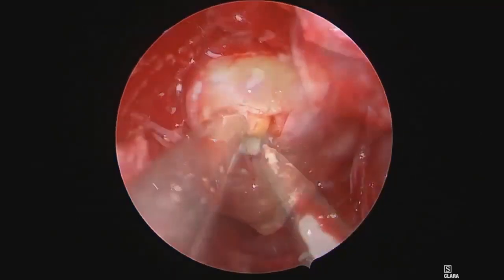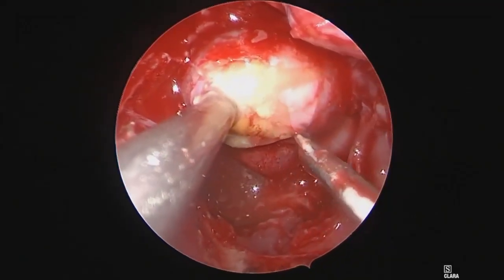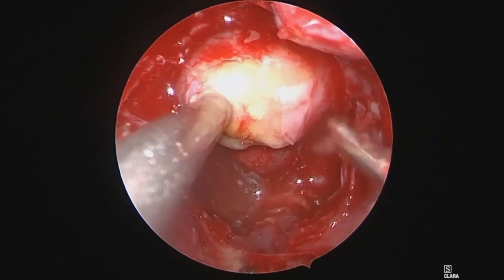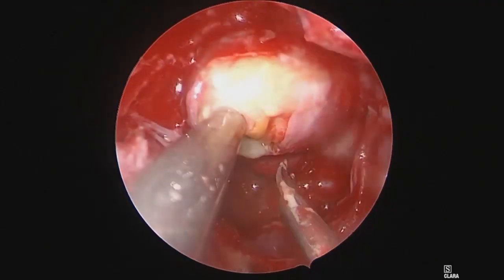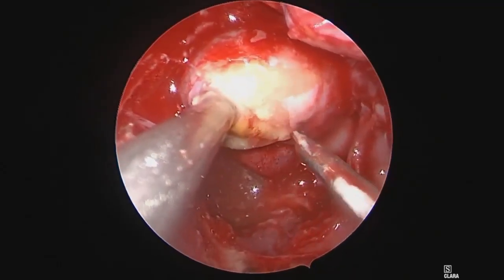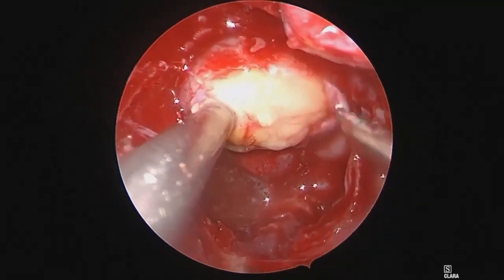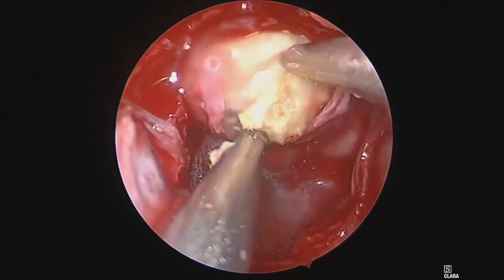Microscissors are used to further expand the dural opening. This is expanded laterally with careful care not to injure the carotids. Oftentimes a Doppler is used to map out the carotids in this moment of the surgery. Once the dura is expanded laterally, double suction technique is used to debulk the vast majority of the dermoid cyst safely.